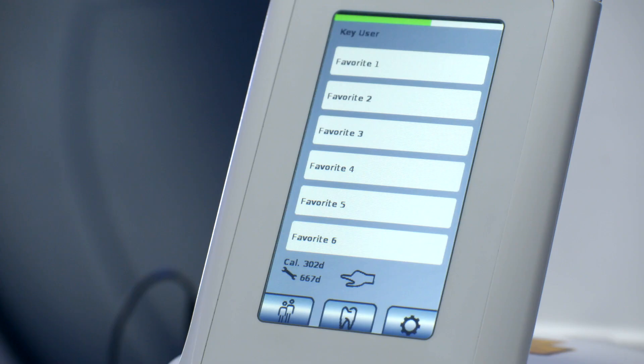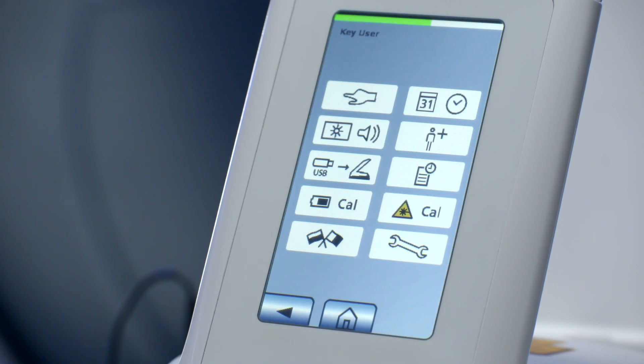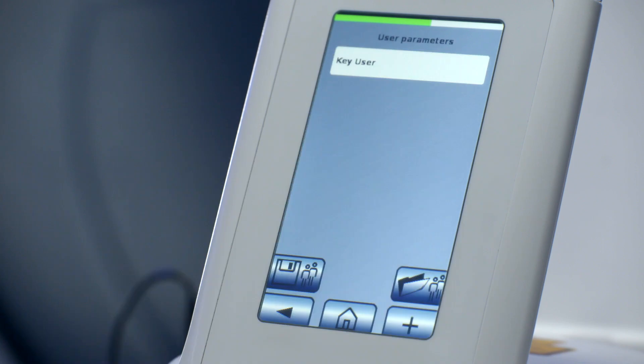From the main home screen, you easily navigate to the user management. When entering the user management, the key user is already configured, like a computer administrator. This administrator has the possibility to create five additional users and to upload or download existing user profiles between devices.